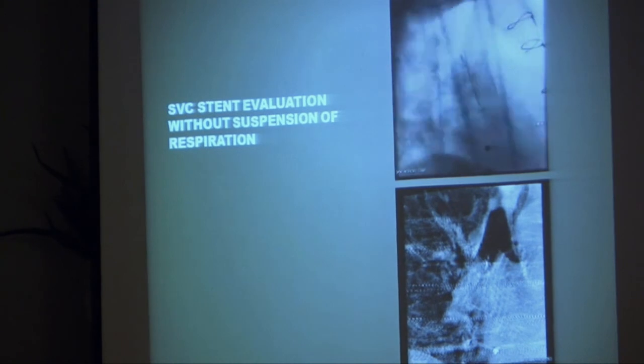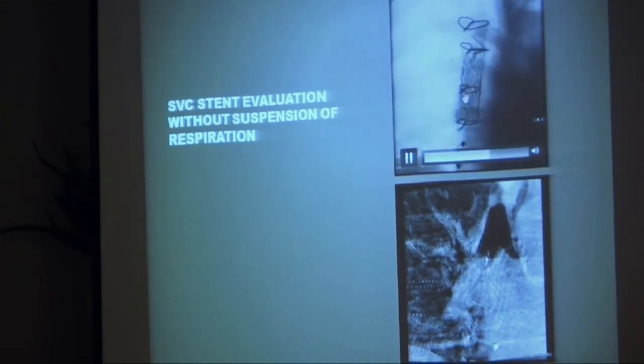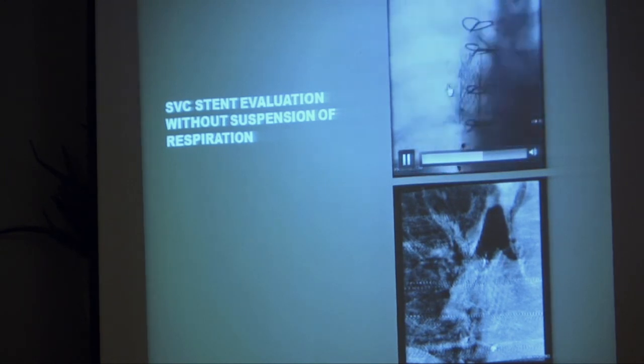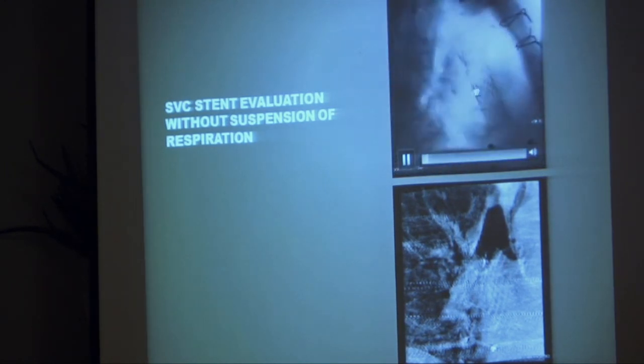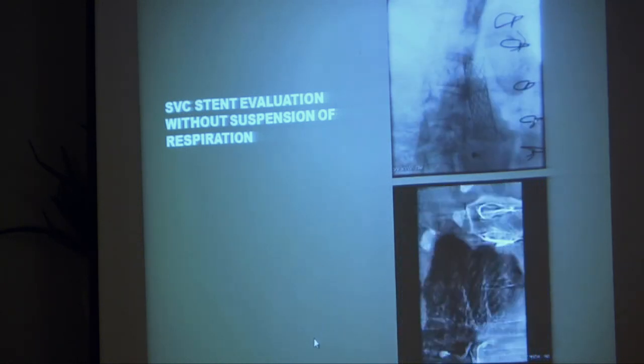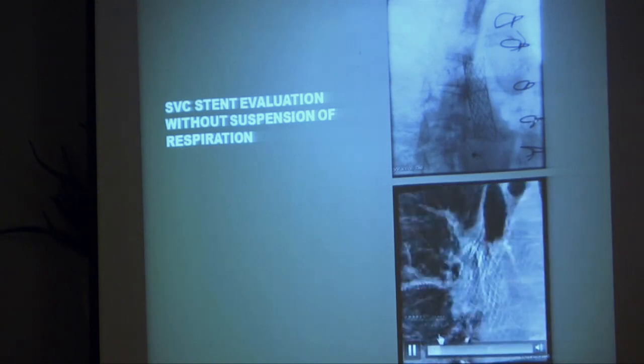If you don't have respiratory suspension, if the patient is breathing, this was a patient that we had put multiple stents in her superior vena cava after a botched anomalous pulmonary vein repair surgery, and her SVC was quite narrowed, so we put multiple stents in there, and we were trying to image these stents and look for any fractures, and this is the rotation, and then here's what it looks like on 3D reconstruction because she didn't hold her breath. Useless. So it's kind of a waste if somebody cannot hold their breath.